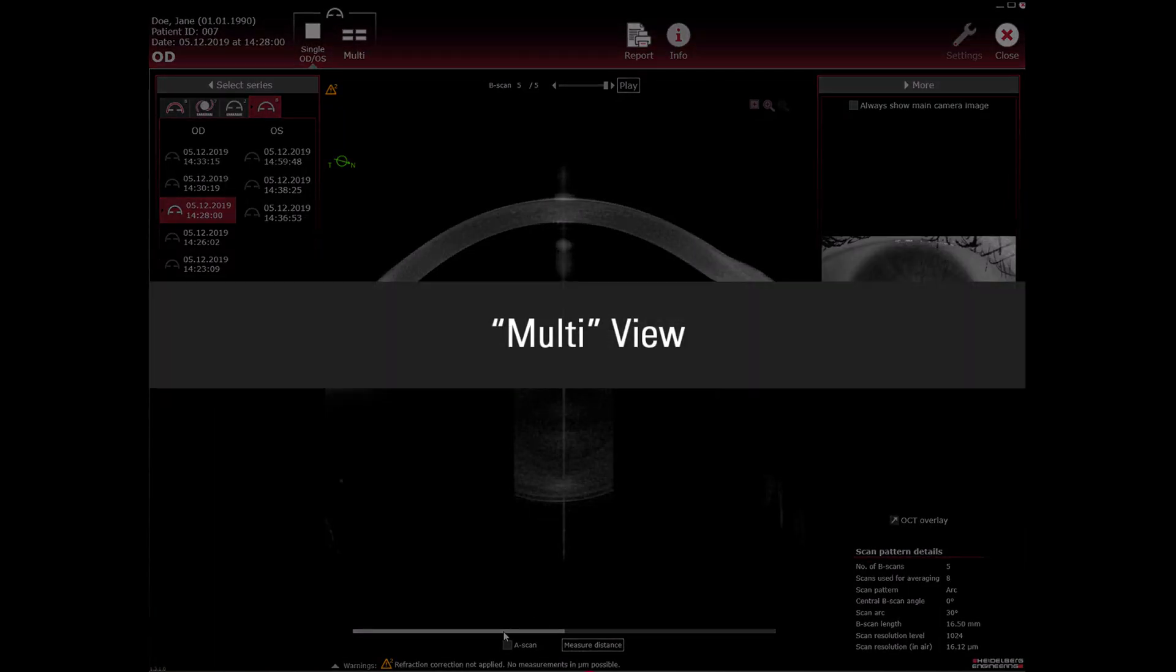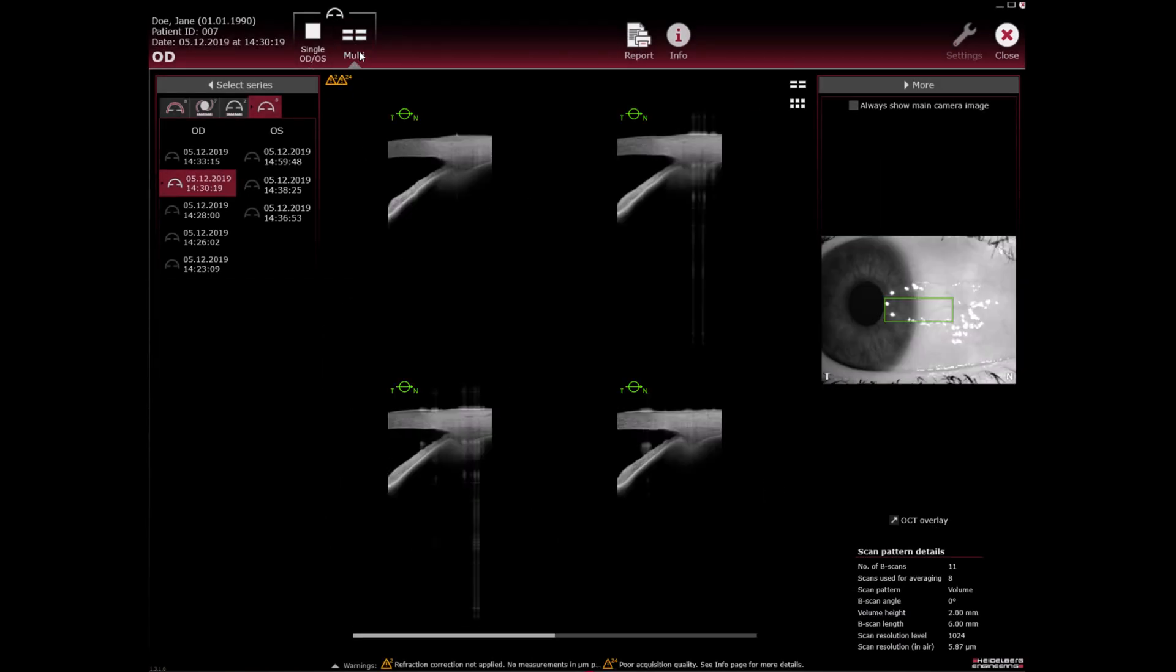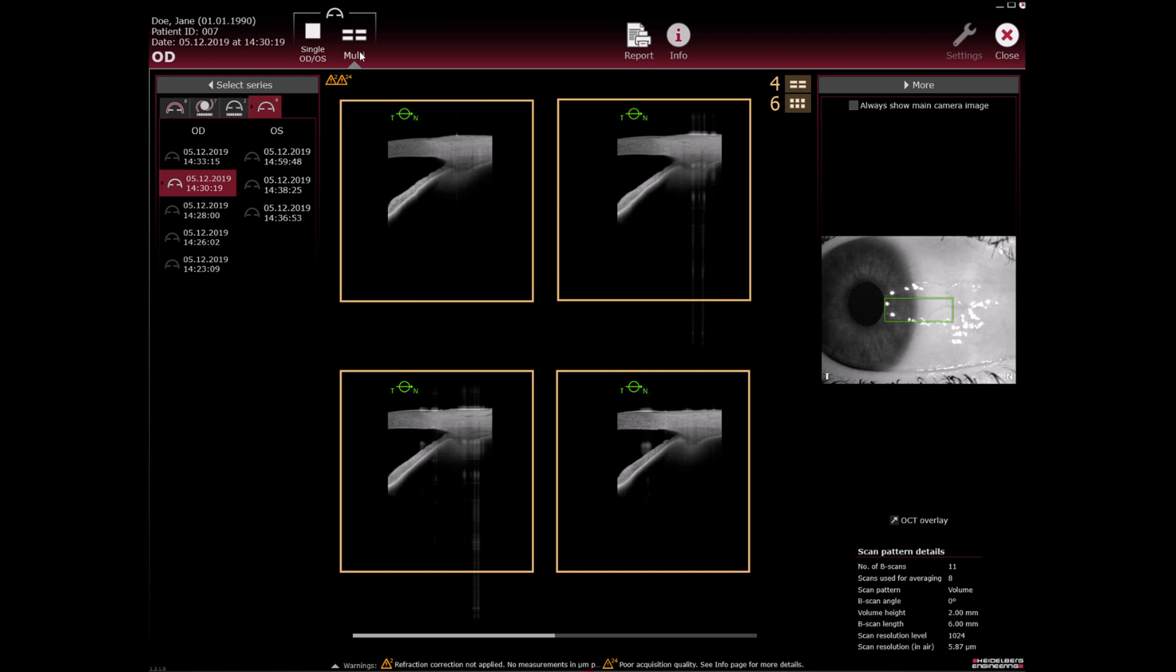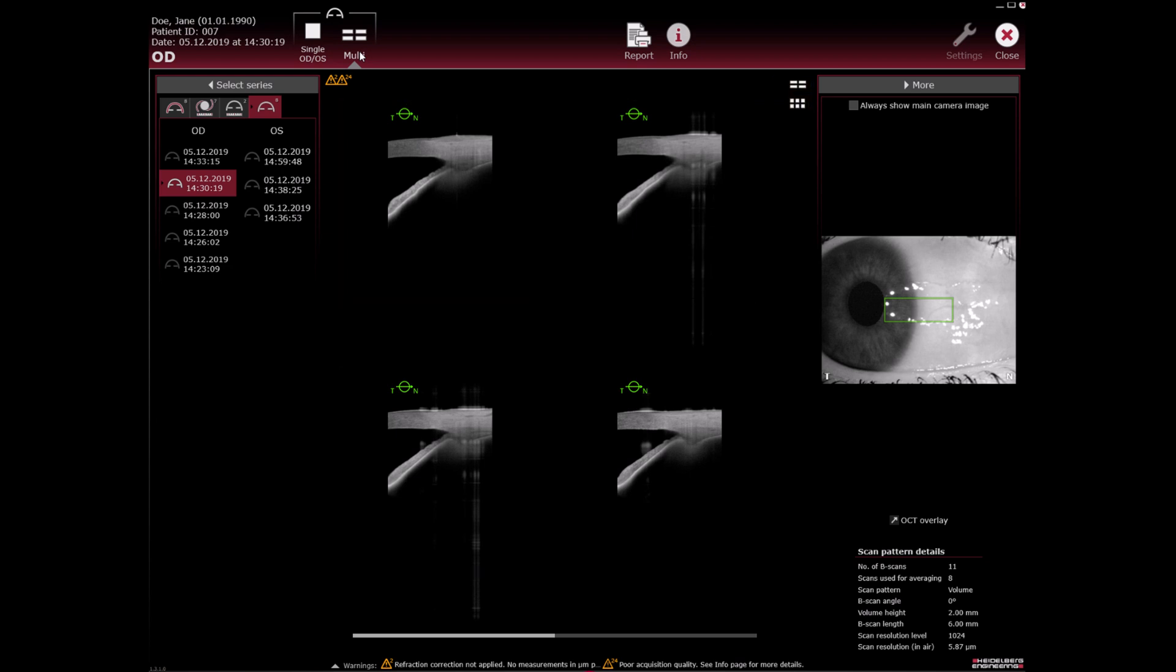Multi view: Either four or six OCT section images can be displayed at the same time.